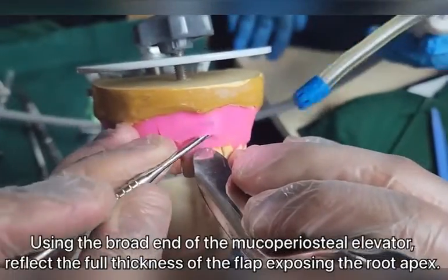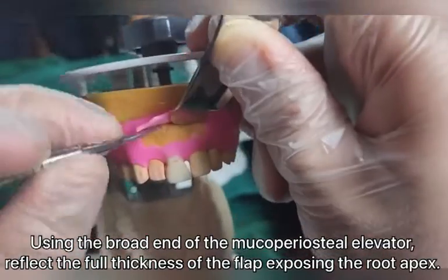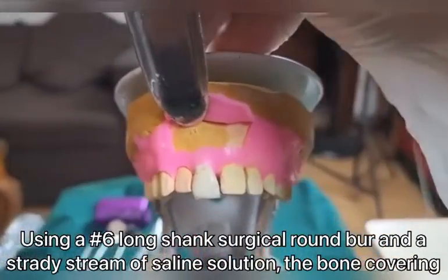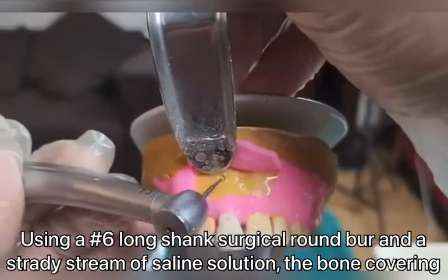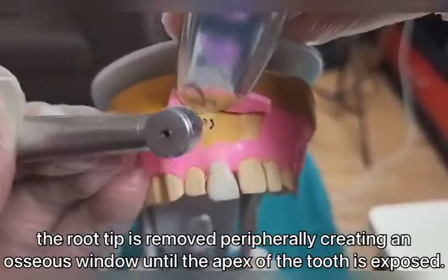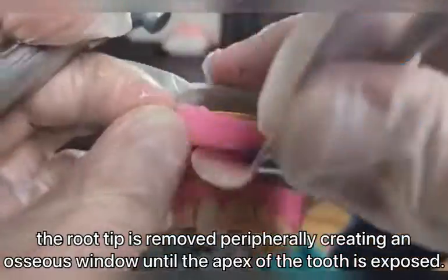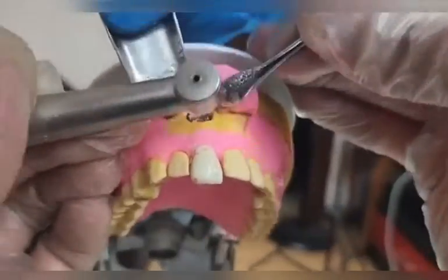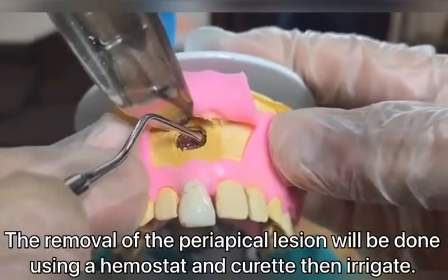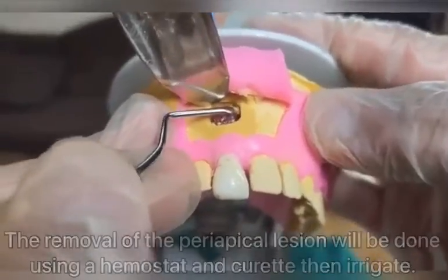Using the broad end of the mucoperiosteal elevator, reflect the full thickness of the flap, exposing the root apex. Using a number 6 long shank surgical round burr and a steady stream of saline solution, the bone covering the root tip is removed peripherally, creating an osseous window until the apex of the tooth is exposed. The removal of the periapical lesion will be done using a hemostat and curette, then irrigate.